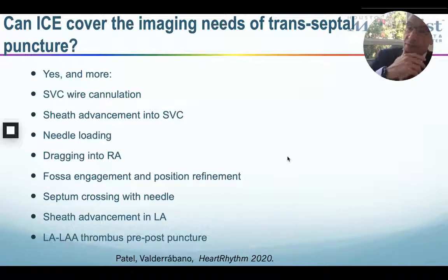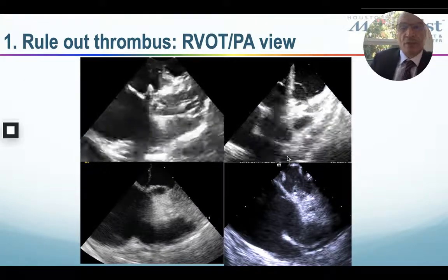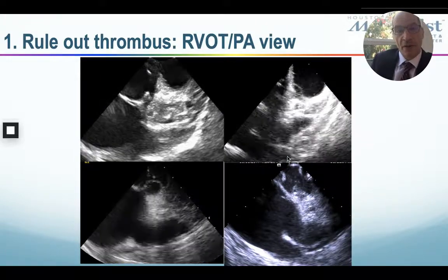We have recently written a hands-on paper on how to do ICE-guided appendage closure device implants, and it's just published in Heart Rhythm last week. So, ruling out thrombus as a first step.